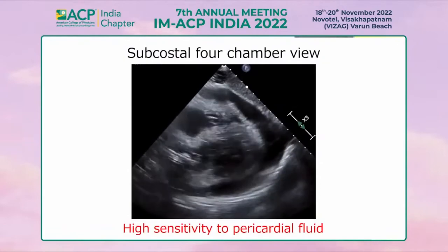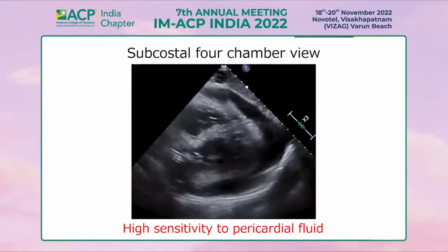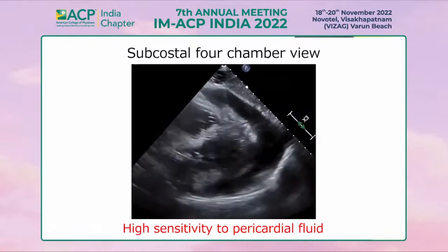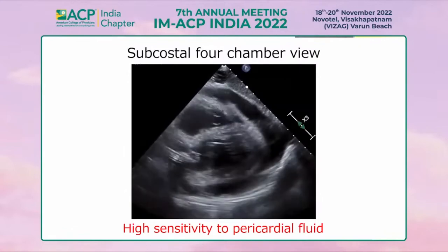This is the subcostal four-chamber view. This view has high sensitivity to pericardial fluid. It is also important that this view is easy to acquire.